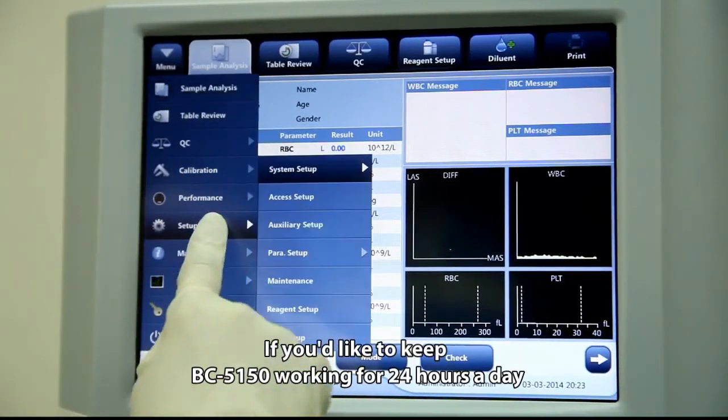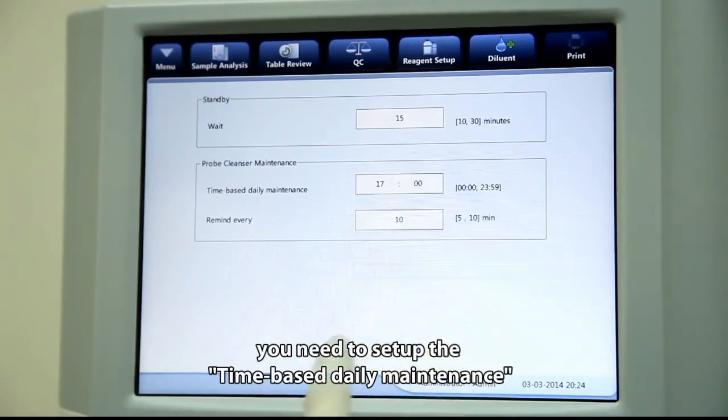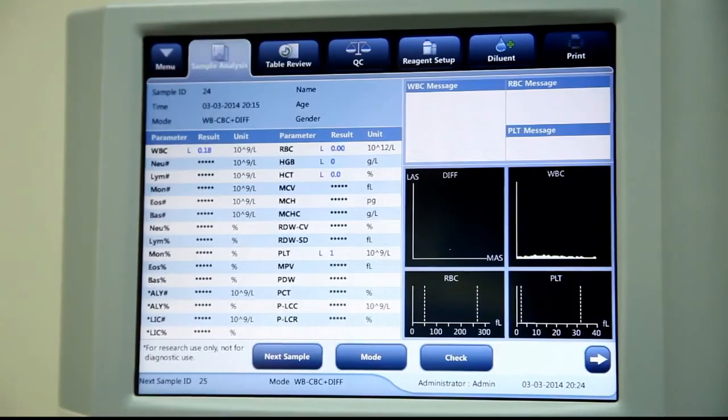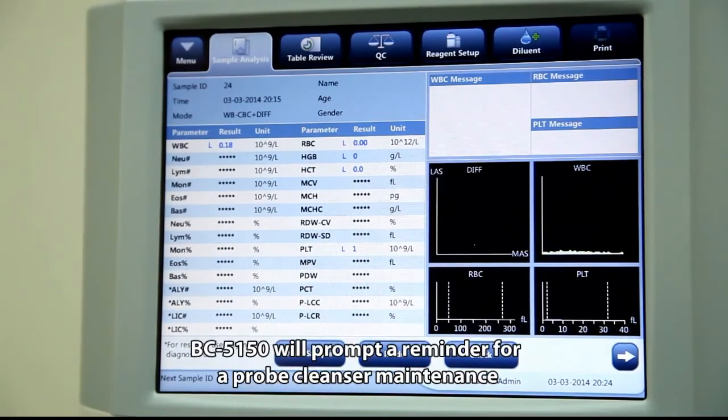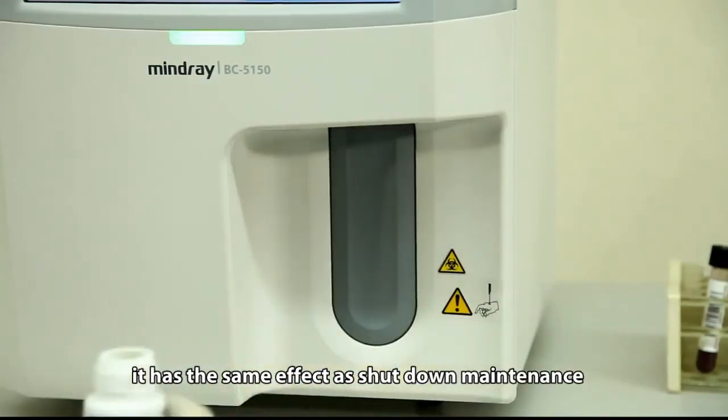If you want to keep the BC5150 running 24 hours a day, you will need to set up time-based daily maintenance. When the scheduled time arrives, the BC5150 will prompt a reminder for probe cleanser maintenance, which has the same effect as shutdown maintenance.